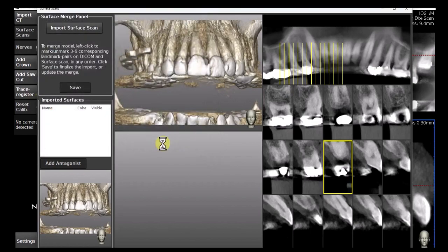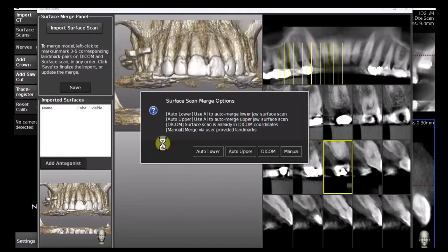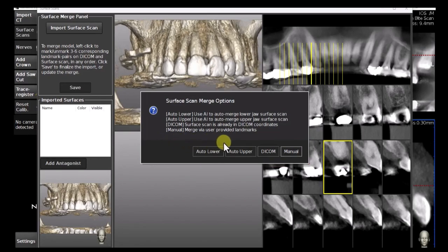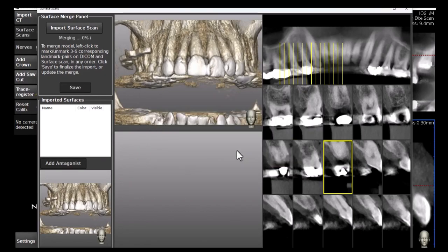A few merging options are available. To use the AI functionality, click on one of the two auto buttons — in this case, it is Auto Upper. The selected surface scan is now being imported and automatically merged to the DICOM.